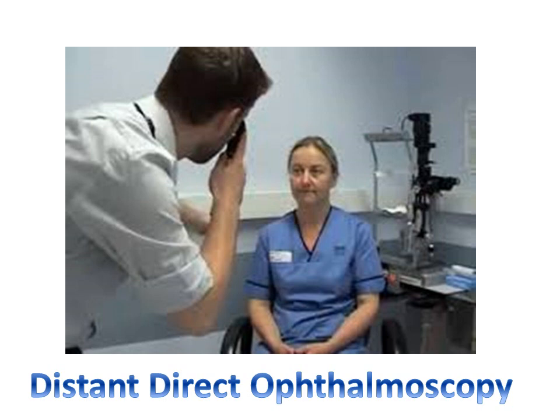Basically he is searching for the fundal glow. If fundal glow is very bright and uniform, then it is a normal case. If there are any opacities seen, then obviously there are some opacities in the media, either in the anterior segment or in the posterior segment.